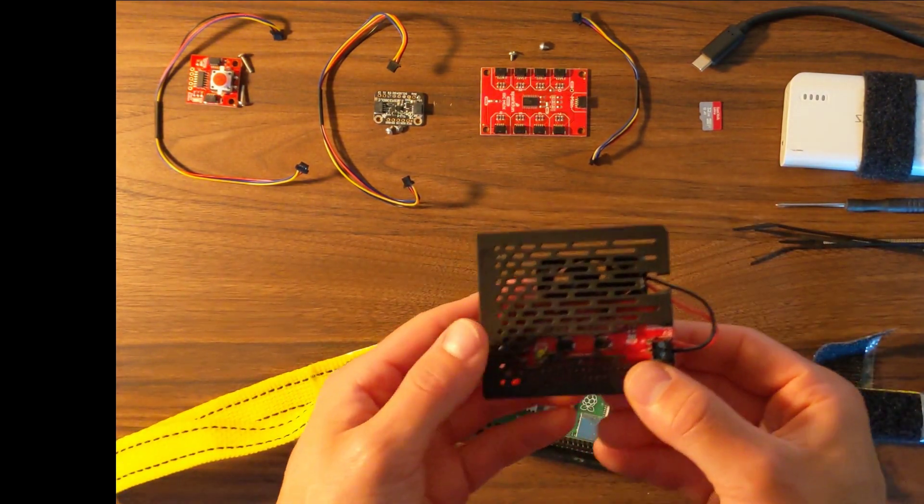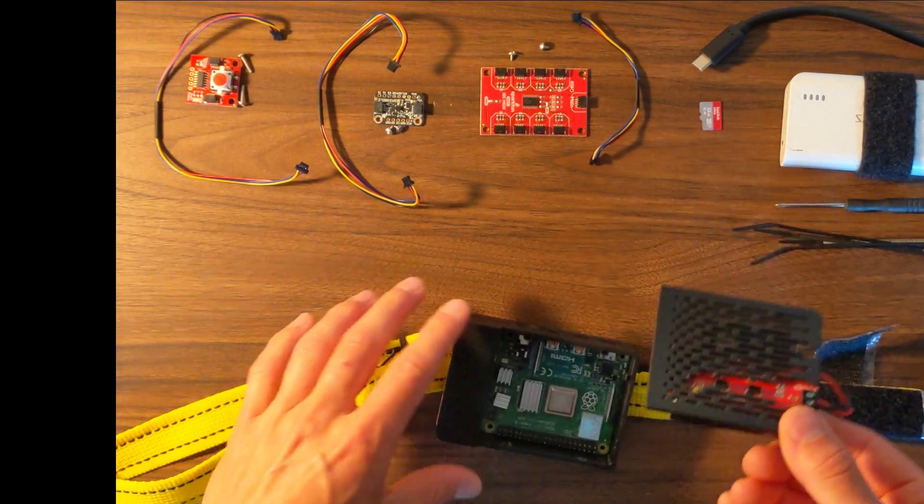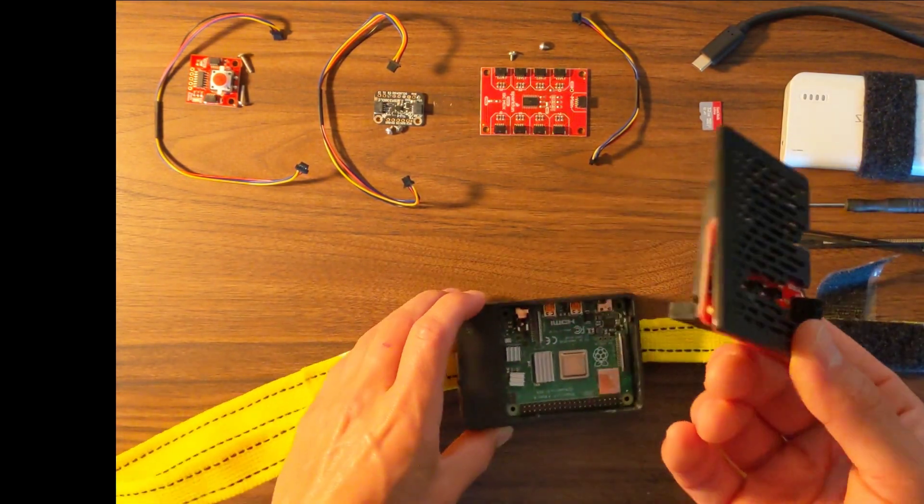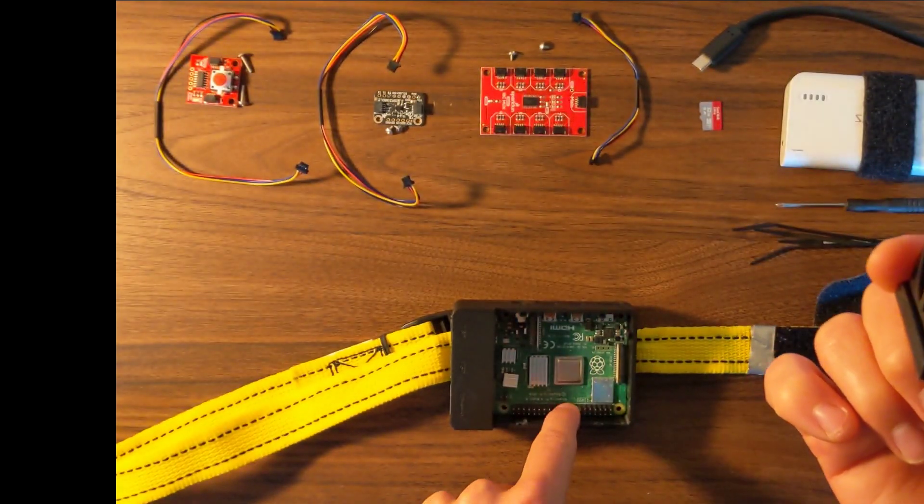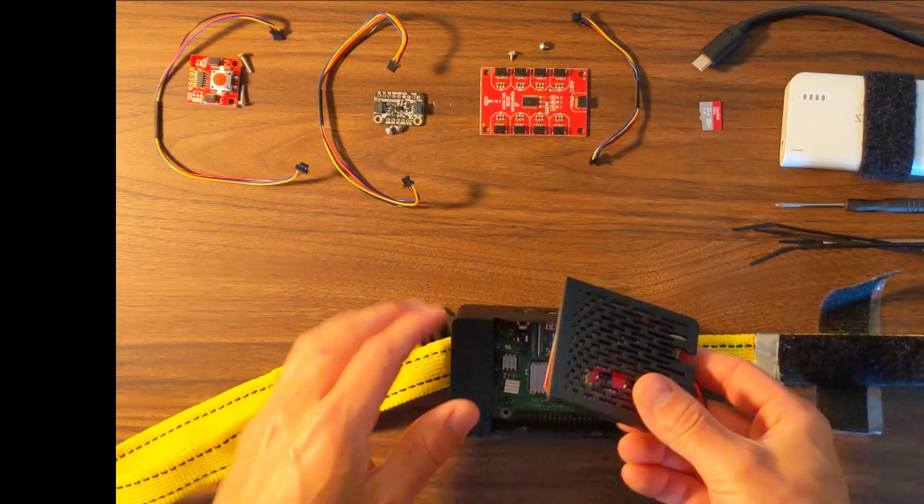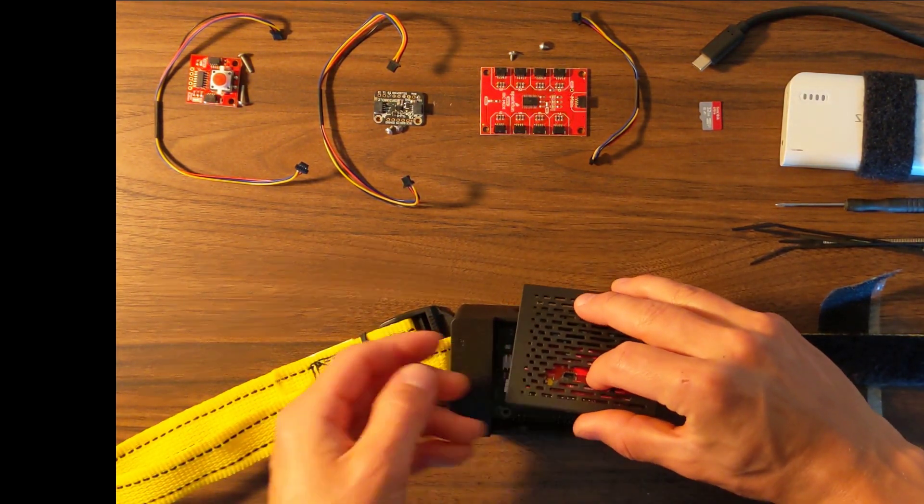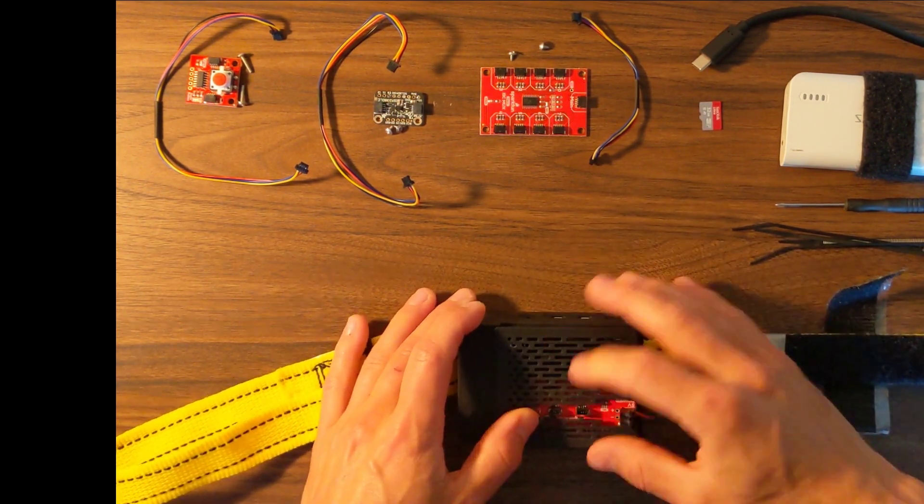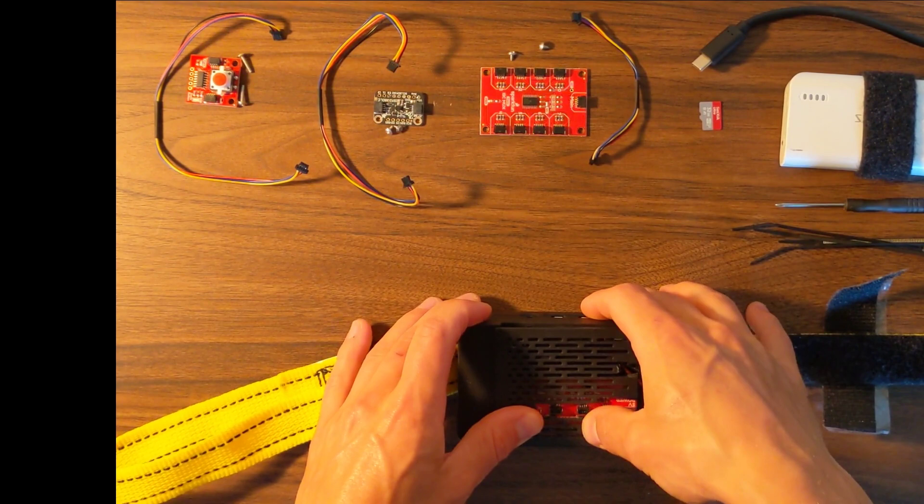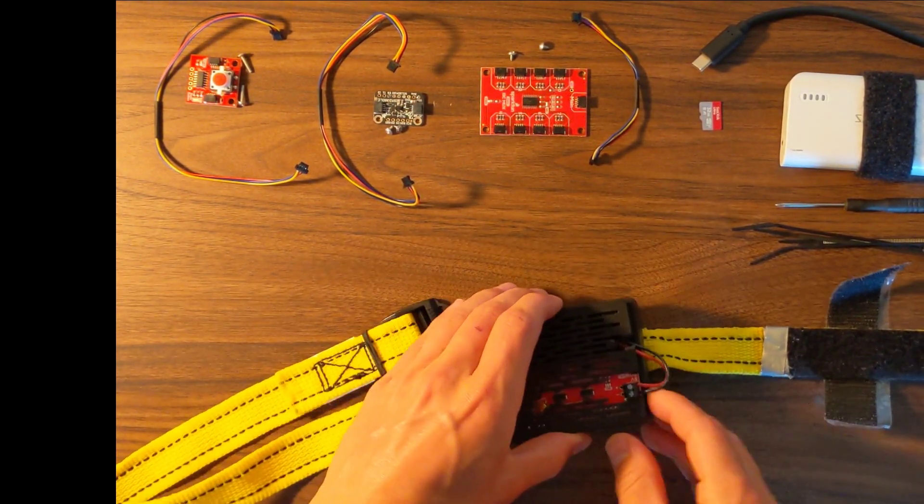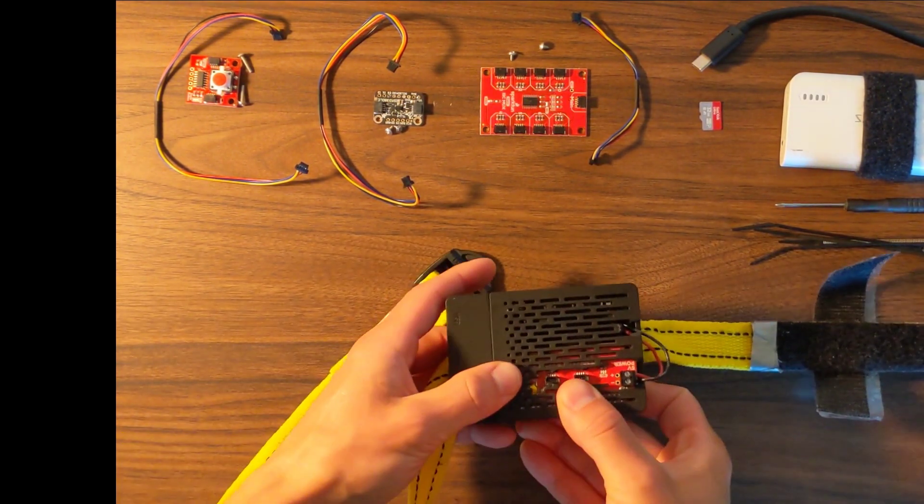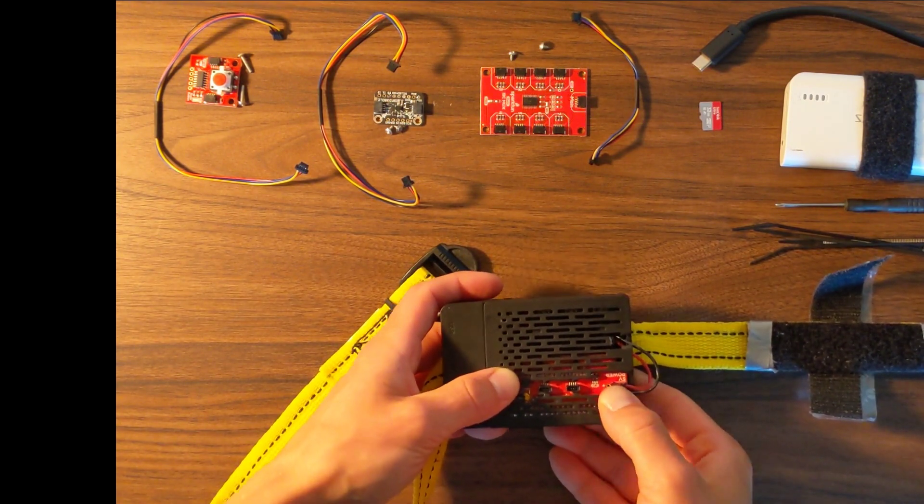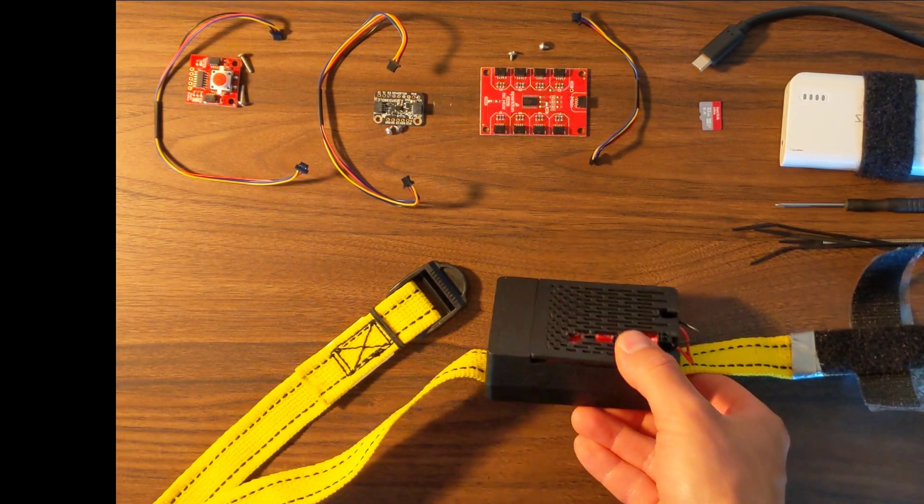Now we will take our little lid assembly and we're going to push this in and we want to make sure that the pins line up with the Raspberry Pi here. This is really the trickiest part of the assembly because it's a little bit delicate and you want to make sure that the pins line up. And then you'll have to make sure that the lid also lines up with the device and then you can just kind of press it in place.